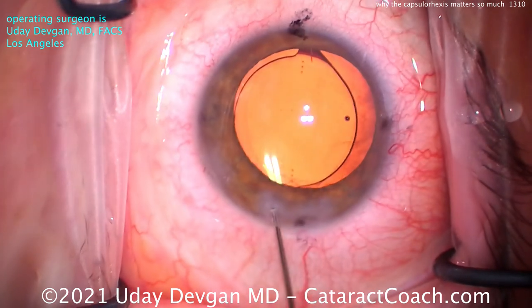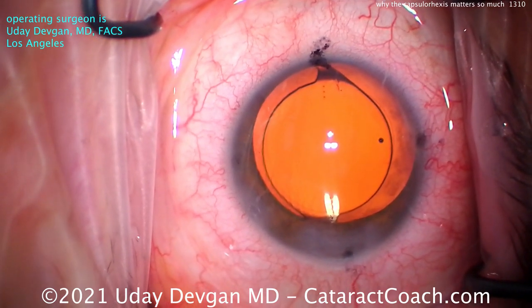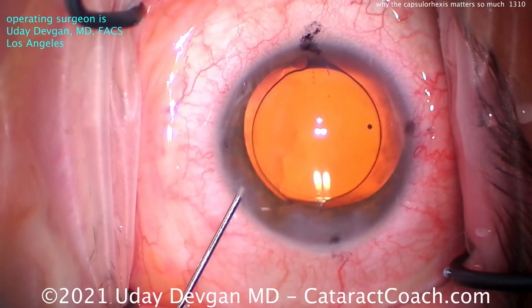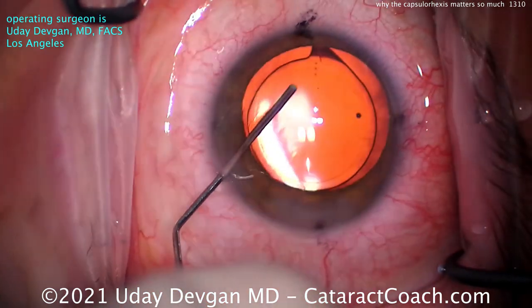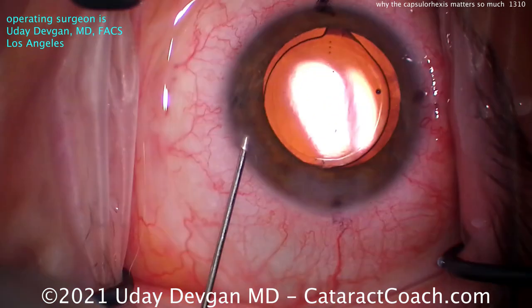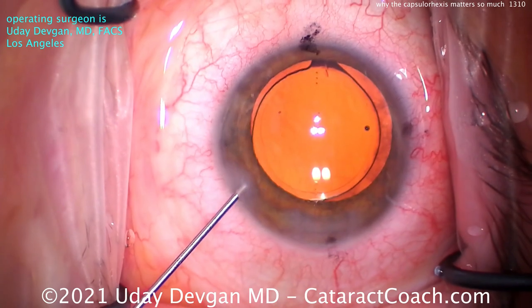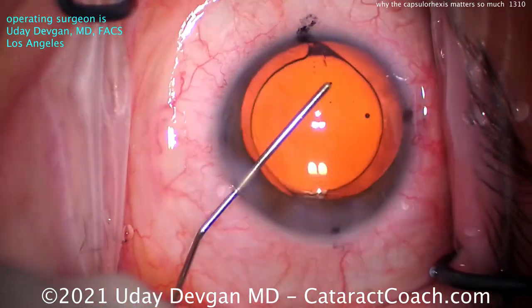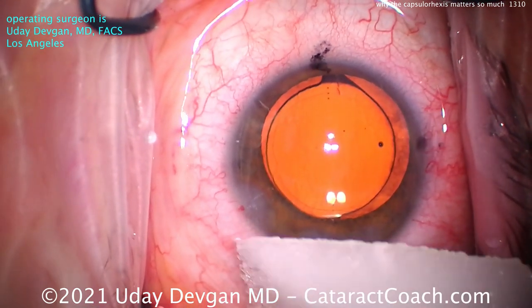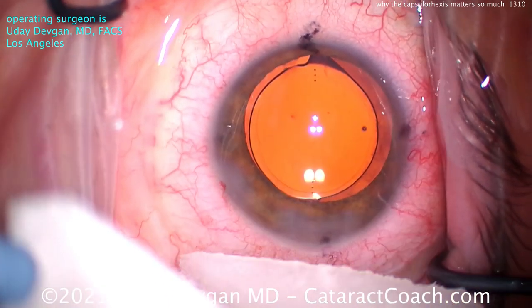So let's seat up that incision and verify our positioning of the toric lens in regards to those toric marks. We'll look very carefully at that rhexis edge and make sure it does overlap. Let's go in there and readjust that lens position — just dialing it in. Look at that, it looks great. So that's about a 5.5-millimeter rhexis, beautifully positioned, with nice overlap for the full 360. I can tell you this patient had a beautiful outcome. We were aiming for plano distance vision — this patient had three diopters of preexisting corneal astigmatism — and we achieved very close to that plano outcome. This patient was 20/20 uncorrected and a very happy patient.